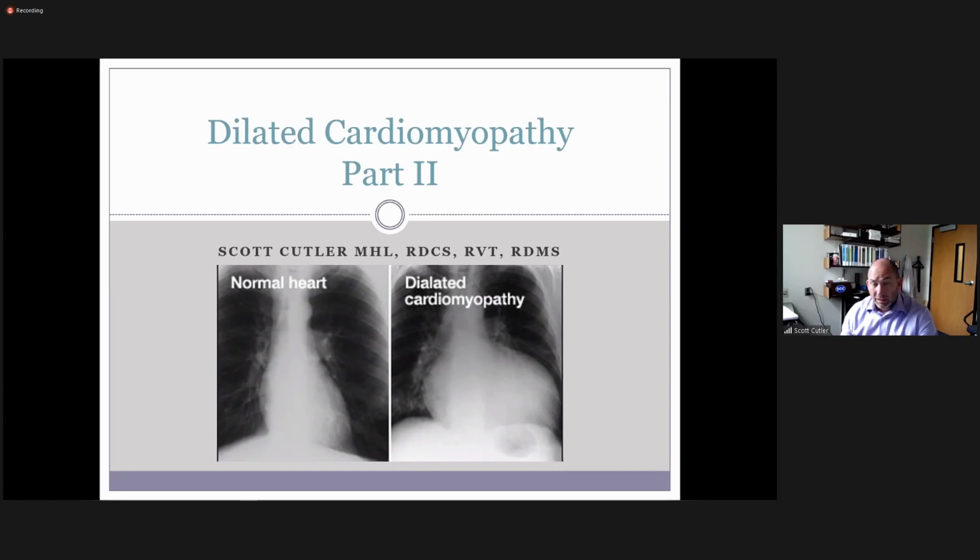As well as all those Dopplers, when they become abnormal, then even though right now we typically, and I think Tyler only has you measuring one waveform per strip, when anything becomes abnormal, you're doing a minimum of 3 consecutive beats. And then again, when it becomes an irregular rhythm, in addition to that, then you're doing 5 consecutive beats each time that you take the strip. So those are things where you would boost your protocol to do a little bit extra once you find the disease process. Otherwise it just takes a lot of time to measure and trace and measure and trace on every little thing, and it could take a lot more time during your exam.